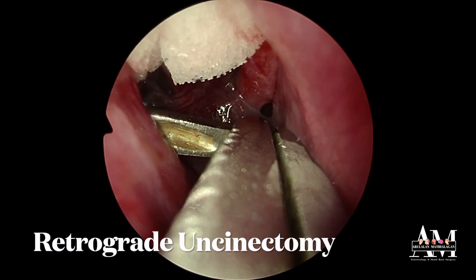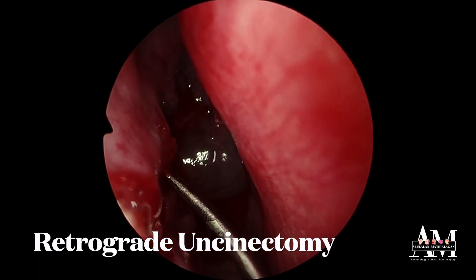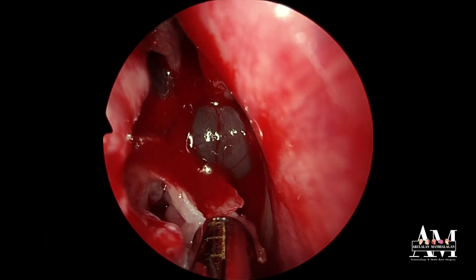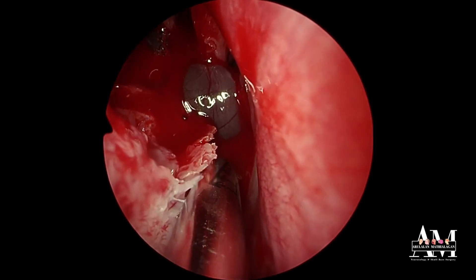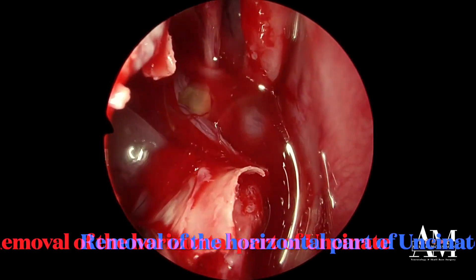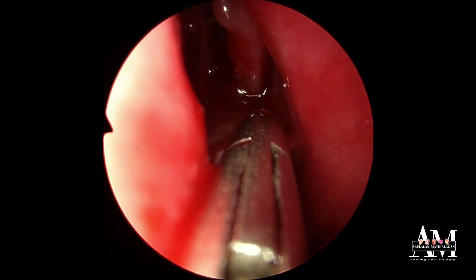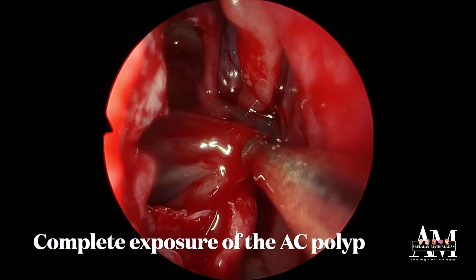The first step is to make a wide middle meatal antrostomy. We start by doing a retrograde uncinectomy. The most important part of the uncinectomy here is to identify the horizontal part, that is the lower part of the uncinectomy. The main area of interest is along the floor of the maxillary sinus. The horizontal part of the uncinate process is identified and carefully dissected and removed from the surgical field to make a clear area to work on the floor of the maxillary sinus.